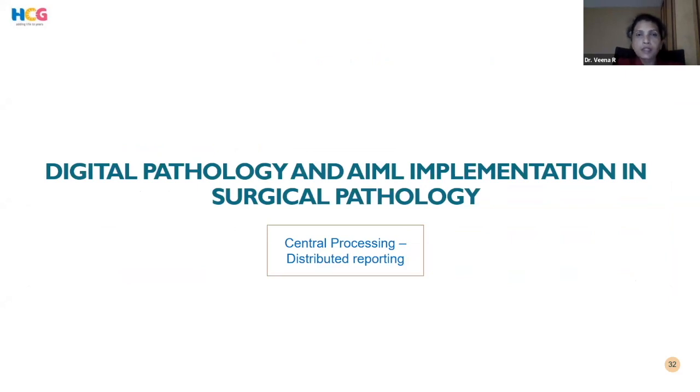Now coming to the digital pathology implementation in surgical pathology. So this is a slightly different concept. So as I said, Bangalore is a reference lab, and the processing, what we planned is to get the samples to Bangalore, process it in Bangalore, and have a distributed reporting. So as I said, we have 10 pathologists in our 10 histopathologists in our network.